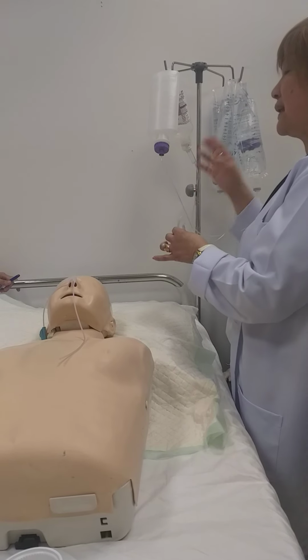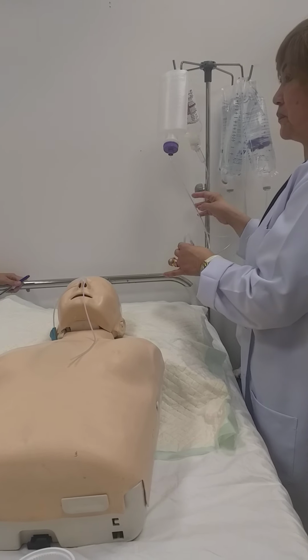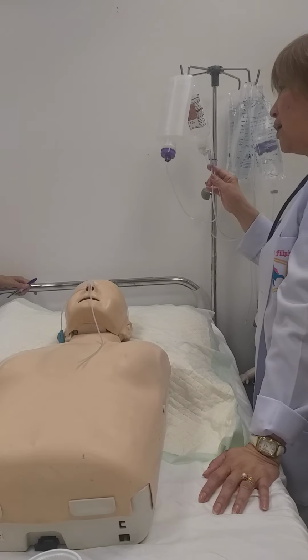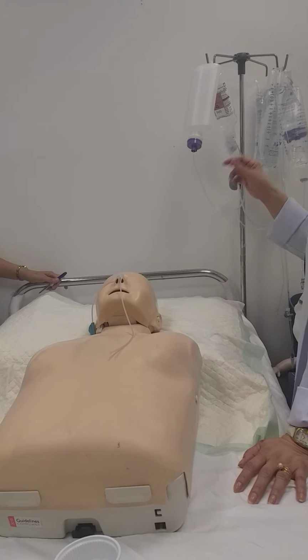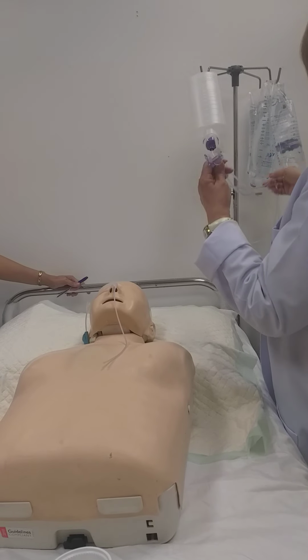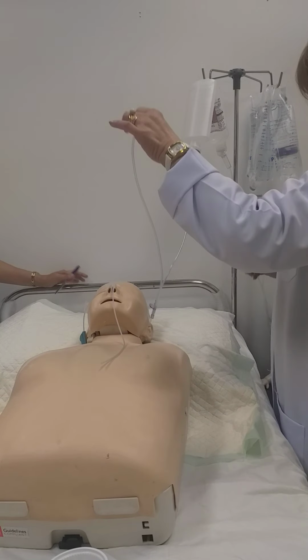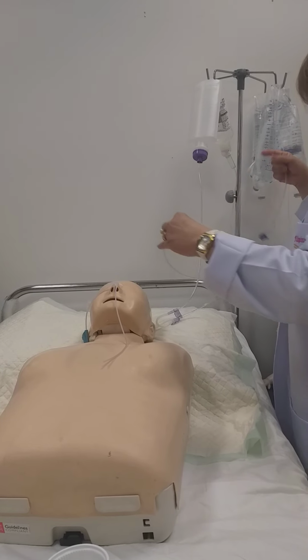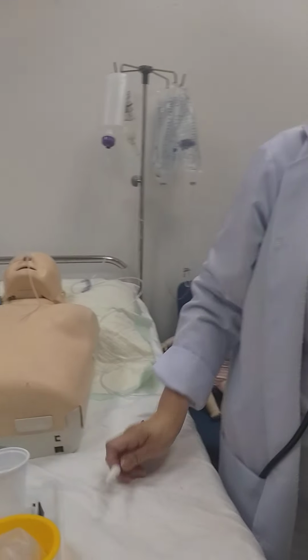If it is 1 liter, 1,000, you have to write there 1,000. And how much per hour? Like 200 per hour or 200 per something, depending on the doctor. So you get the end of this. If not with the machine, you can go directly with this. Can you just put this one here?